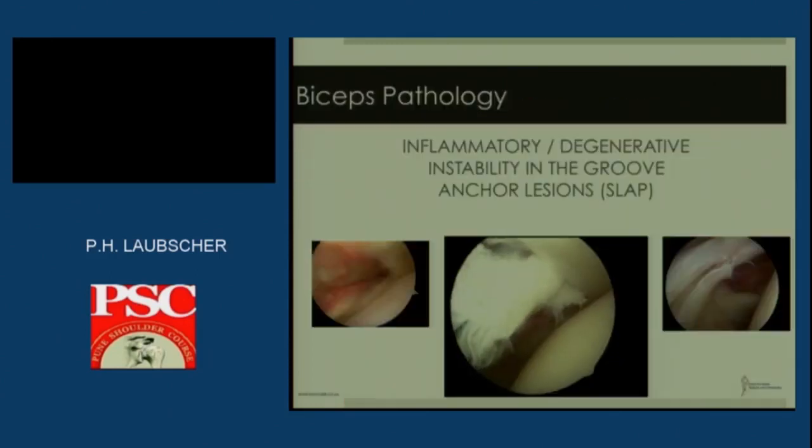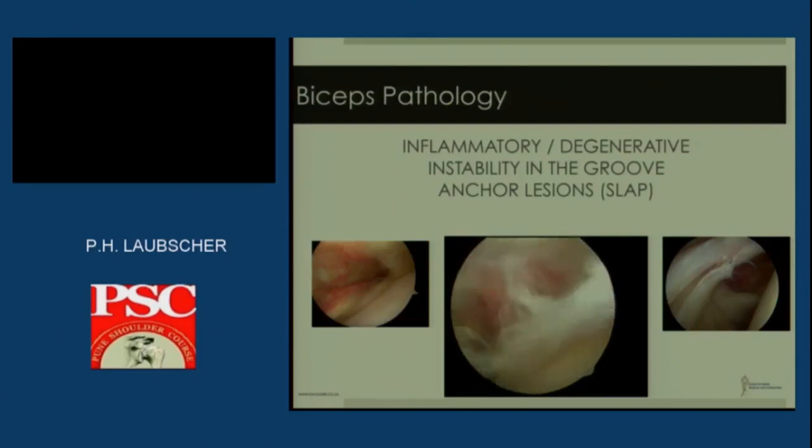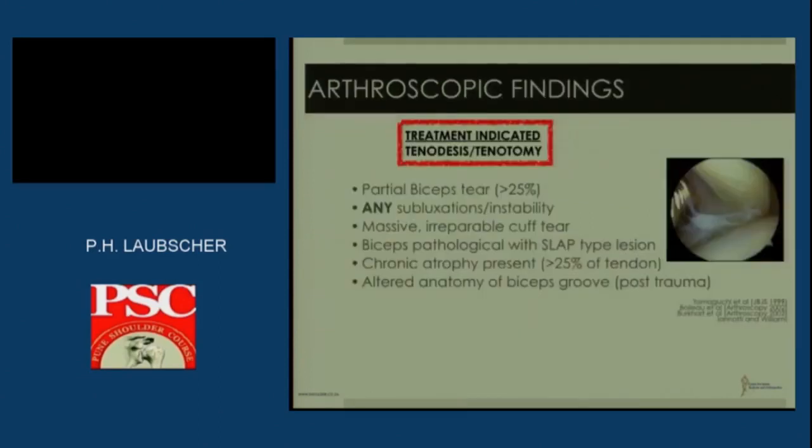we have. Just looking at why we're doing a tenodesis, obviously it's often in cases where we have degeneration, biceps pulley lesions, instability in the groove, and then of late SLAP lesions we tend to treat more aggressively by means of a tenodesis. I do a tenodesis or tenotomy in cases of partial biceps tear, any instability, irreparable cuff tears or massive cuff tears, pathological SLAP lesions, and atrophy of the tendon.